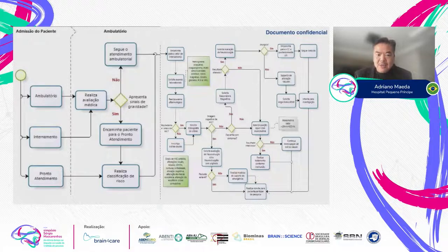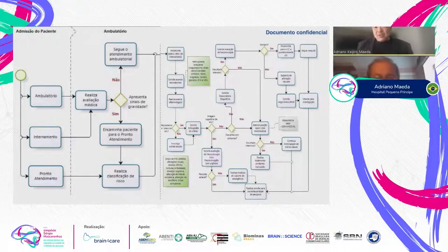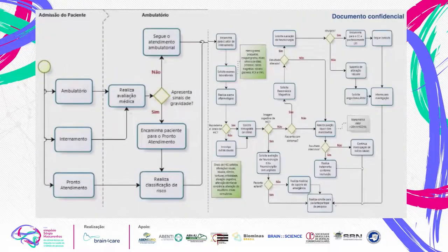We compile patients, assess them, and if there is a suspicion of ICP, or if there is any test that shows they have increased ICP, if they have edema, if they have anything in their optic nerve, eye fundus, we investigate. We look for the cause of the ICP, and sensors are placed on the subject. We assess the patient in the standing and sitting position.